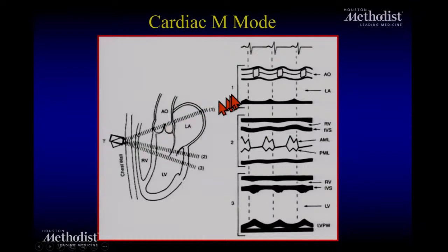And once they close, there you go. I have one line that's moving a little up and down because the cardiac base moves a little bit. If I'm at level 2, close to the mitral valve, what do I see? I see the RV free wall, I see the right ventricle, and it's obviously through this ice-pick view of the heart. I see the septum.